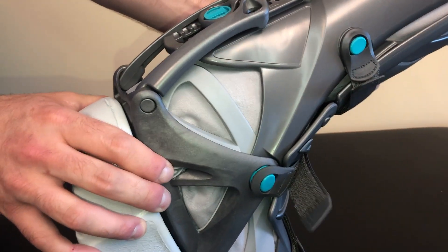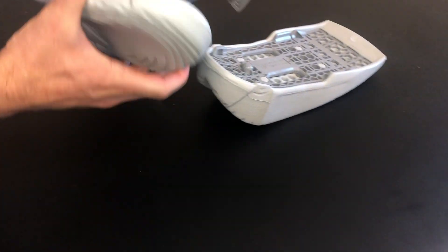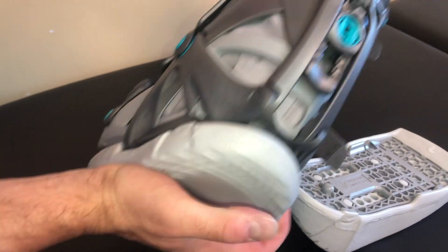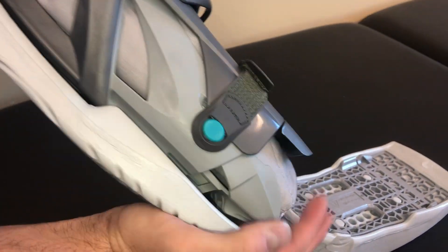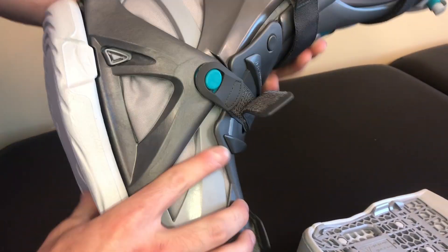To remove the footplate, press on the small triangle located on either side around the heel area of the footplate — this will release it. To reattach, simply line up the footplate with the bottom of the boot and press into place. When the footplate is secure, you will hear it click.